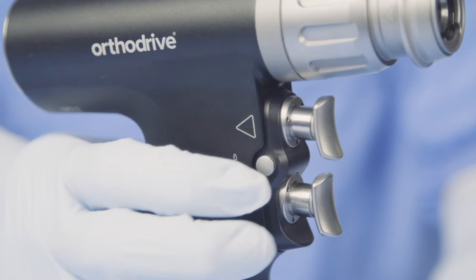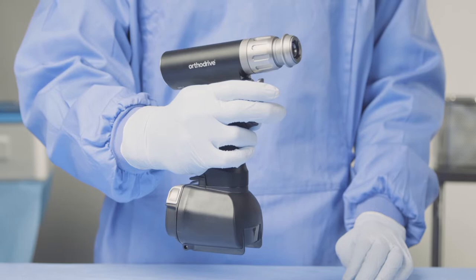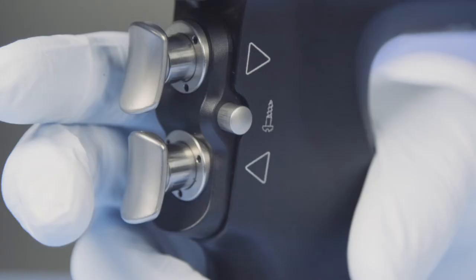If I push the mode selector across on this side, the tool will run at 100% drill speed. Depressing both triggers on this side will run the tool in an oscillating fashion.